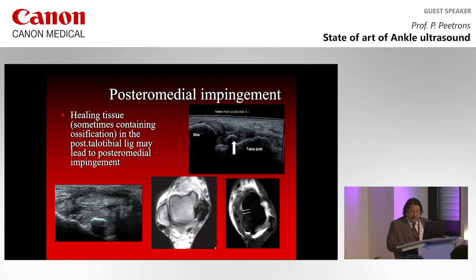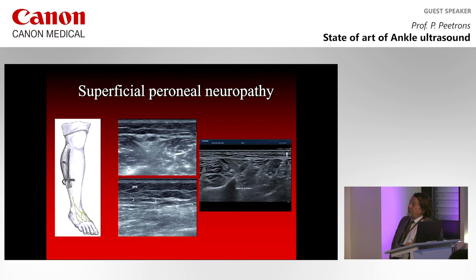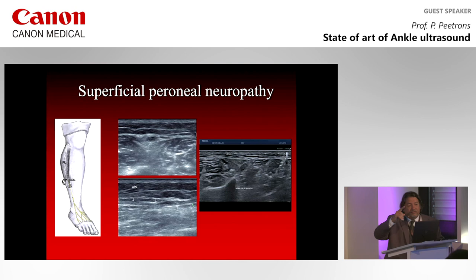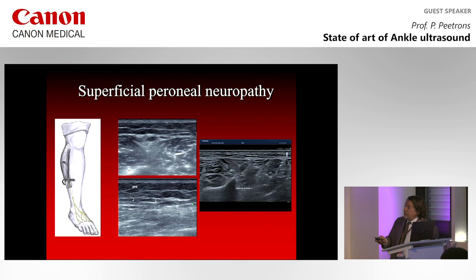So another thing that you have to know, this is an update, we are speaking about updates in ankle sonography, is the involvement of the superficial peroneal nerve. So when you have recurrent ankle sprains, sometimes the reason is not in the ankle itself, it comes from above. It comes from a stretching of the superficial peroneal nerve. I don't know if you remember this nerve, it's coming from the common peroneal nerve. It is following the peroneal muscles, and it's going away from the peroneal muscles there.